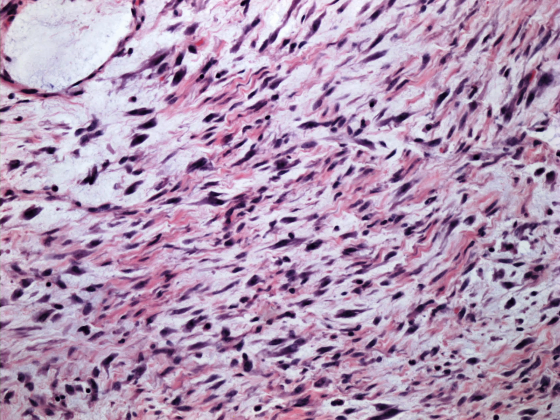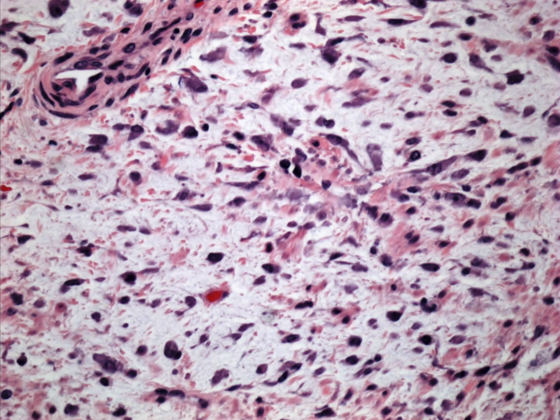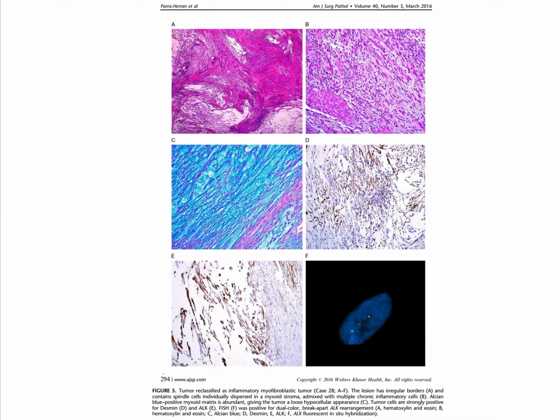There are some lymphocytes here as well as some plasma cells, and that's not coming through great on this image, but I can tell you under the scope it was a lot easier to see. And you can see here some inflammatory cells as well. And here you're getting an idea of some pycnotic change, but also some inflammatory cells.